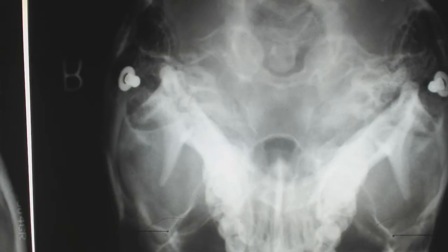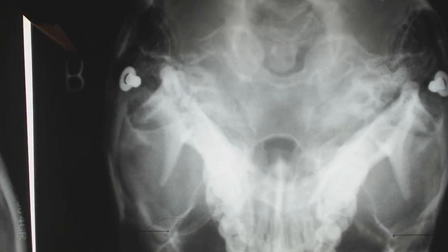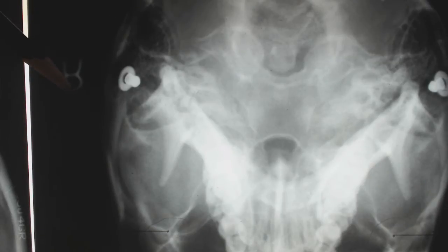This one is actually one eighth of an inch, so we're good. Let's get into the marking. Base posterior — we're looking at the right joint and left joint of the condyle. When we're marking a base posterior, here's the right marker on the right side, so we know this is the right and that's the left. You see two earplugs here — that's how we're going to reference our convergence angles.